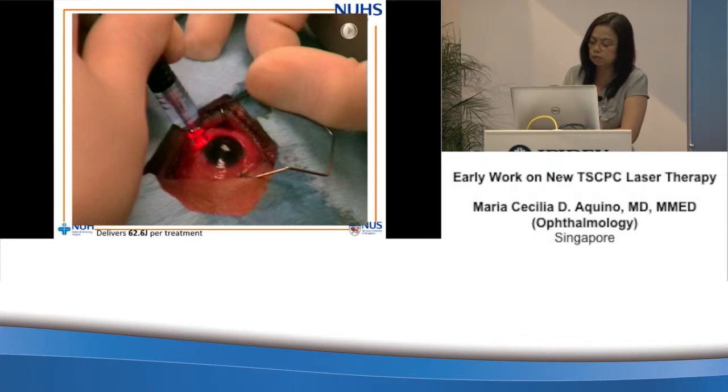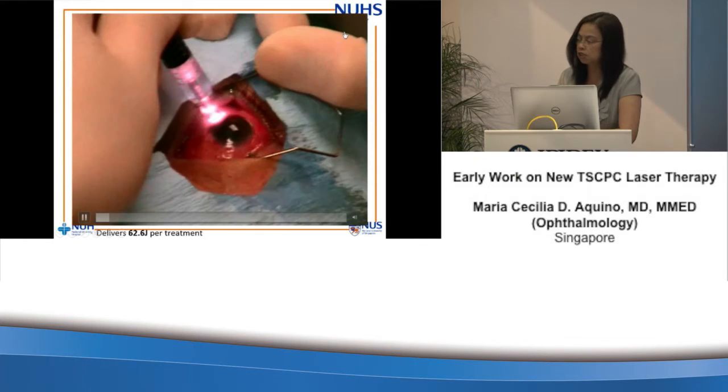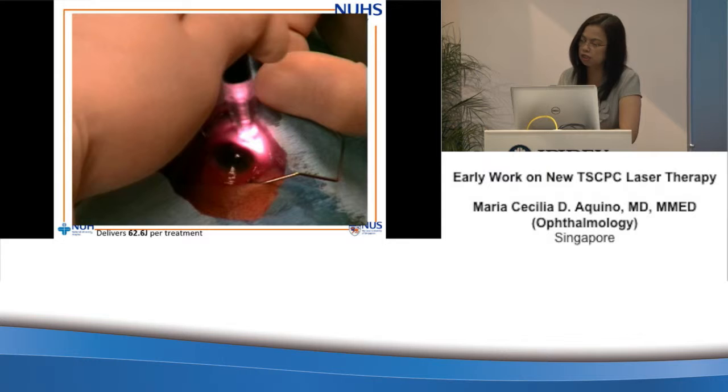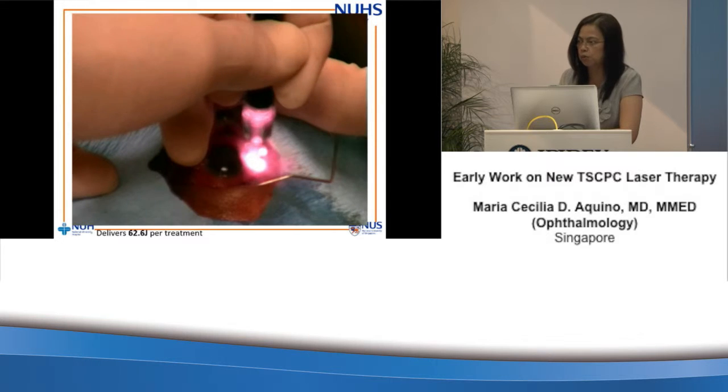And here is the technique that we use in order to deliver micropulses during cyclophotocoagulation, using the customized micropulse probe. Instead of applying the laser individually as we usually do with the G probe, you just slide it in a painting fashion. The duration that we have found effective is about 100 seconds for the total treatment, covering both the superior and inferior quadrants, avoiding the 3 and 9 o'clock positions.